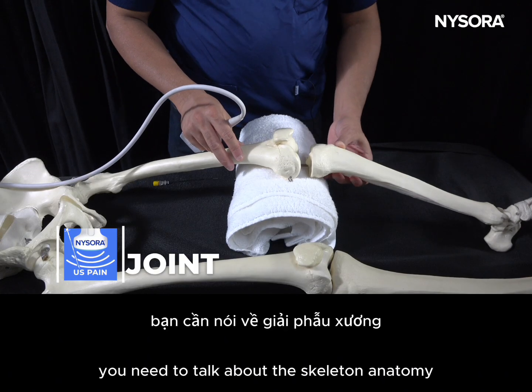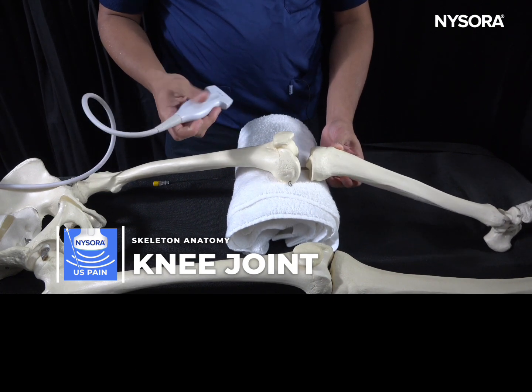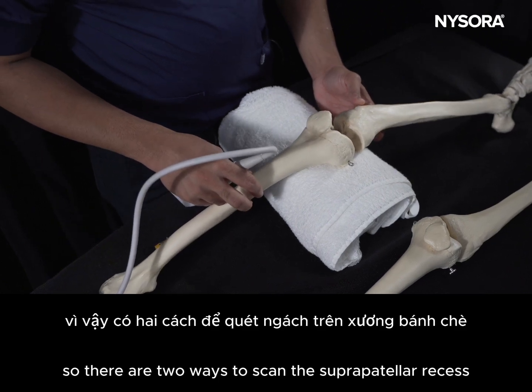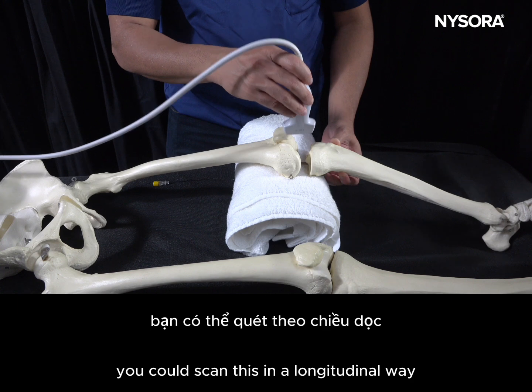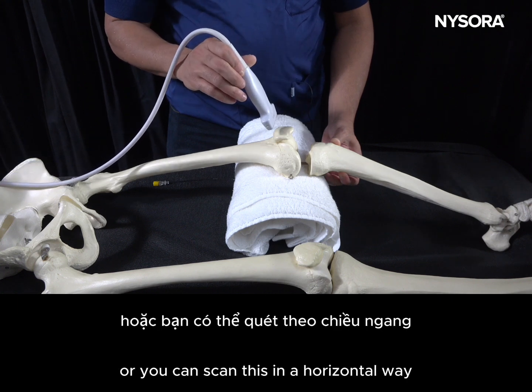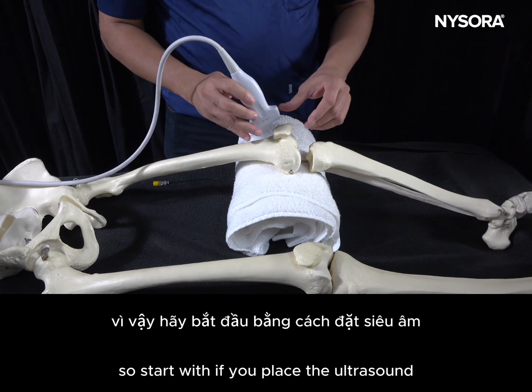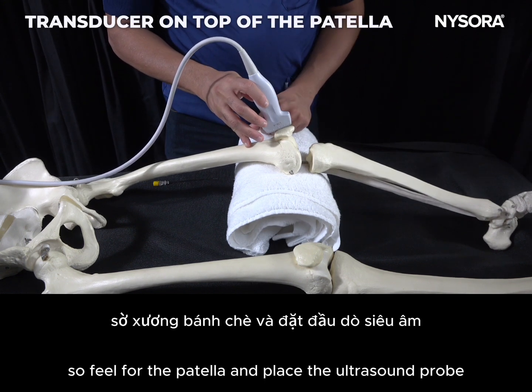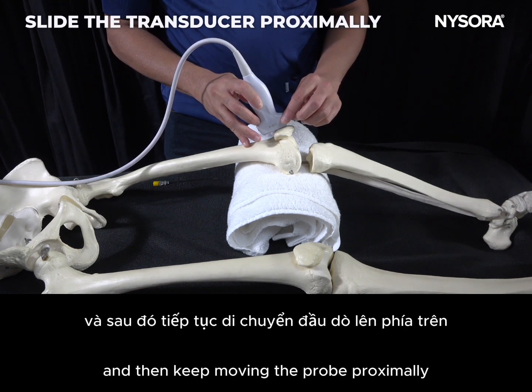Going to talk about the skeletal anatomy pertinent to the knee joint injection. There are two ways to scan the suprapatellar recess of the knee joint capsule. You could scan this in a longitudinal way, or you can scan this in a horizontal way. Start by feeling for the patella, placing the ultrasound probe on top of the patella, and then keep moving the probe proximally.